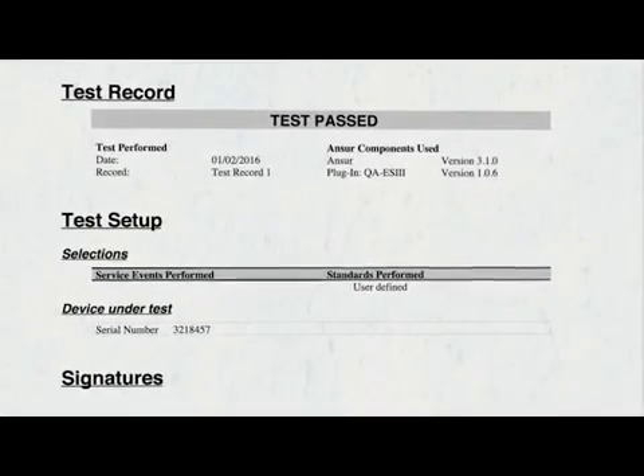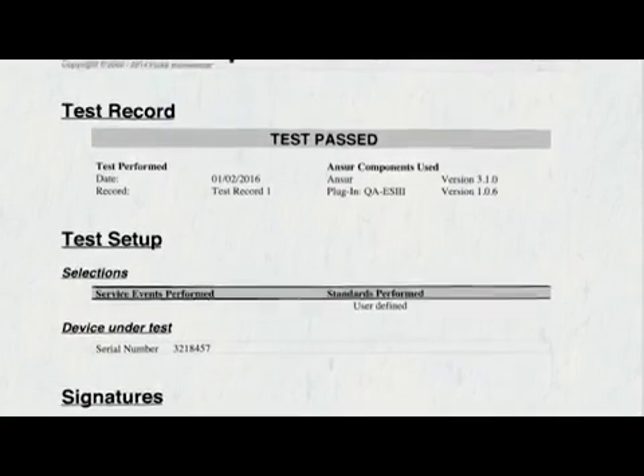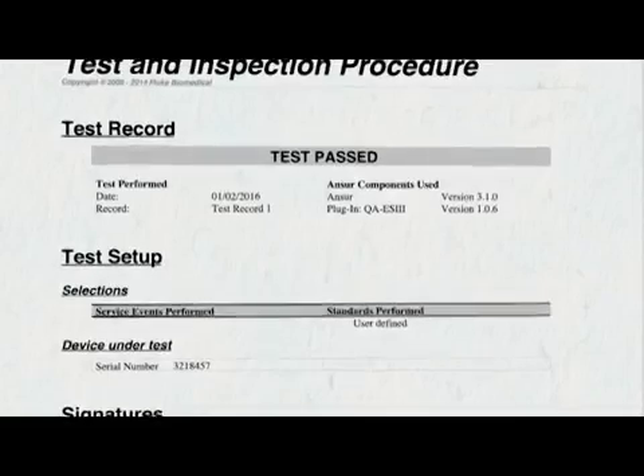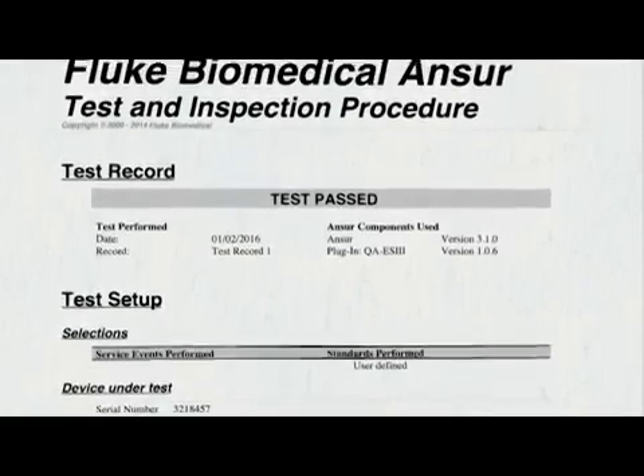Ansur software can produce a single electronic test report, which displays all preventative maintenance tasks, including visual inspection, electrical safety, and performance characteristics.